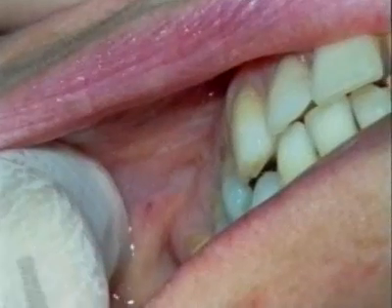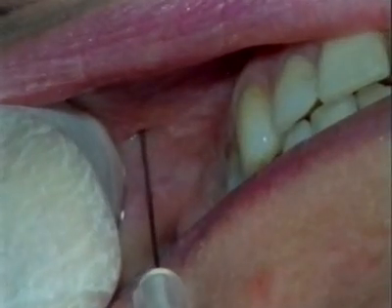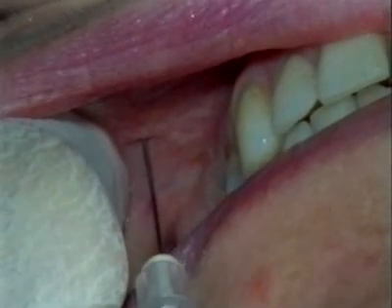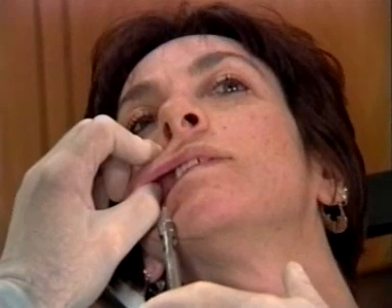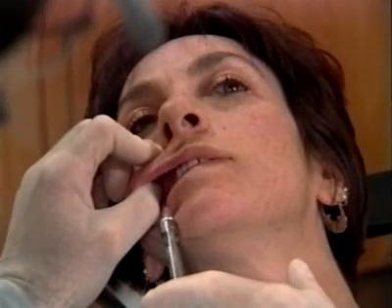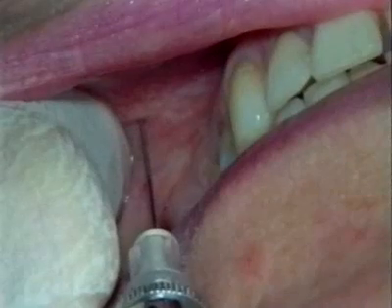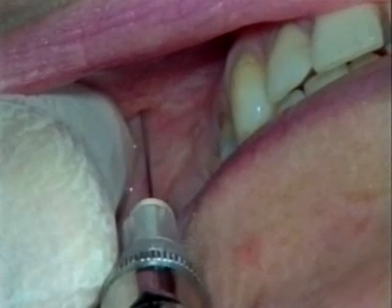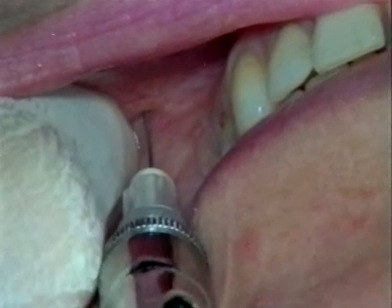The needle is then inserted vertically, about 5 millimeters lateral to the second premolar and parallel to the long axis of the tooth, with the bevel of the needle facing distally. The orientation of the needle as seen from the front of the patient should mirror a vertical line defined by the medial aspect of the pupil and the infraorbital foramen. For this and other injections described in this program, a few drops of anesthetic, expressed as the needle is slowly advanced, is useful to minimize discomfort. The average depth of penetration is about 15 millimeters.